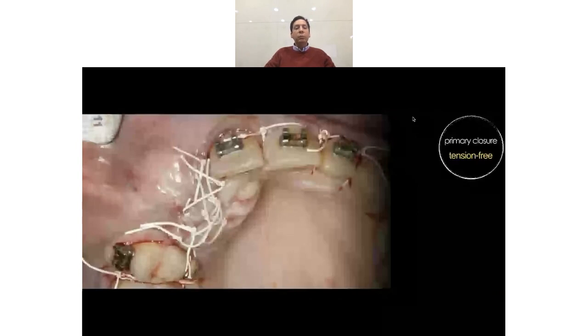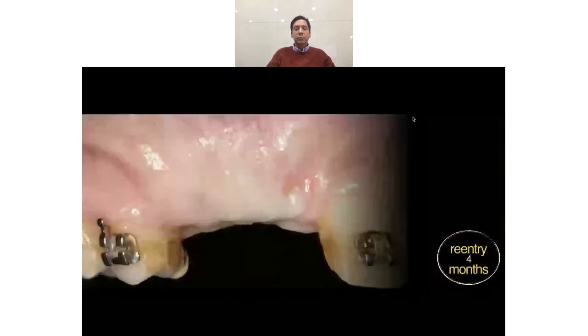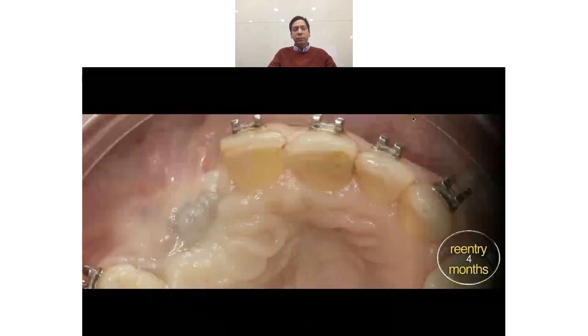And then we close the sutures, and you can see here that we place every papilla in the right place. This is the final result. And this is the aspect 4 months later. 4 months later, the healing has been uneventful. Everything has gone fine. And now we're gonna do the re-entry.